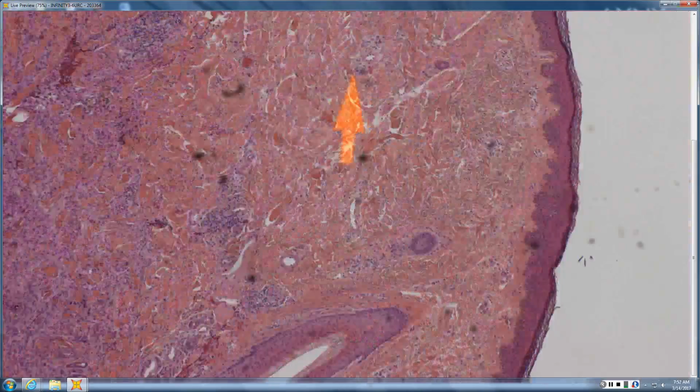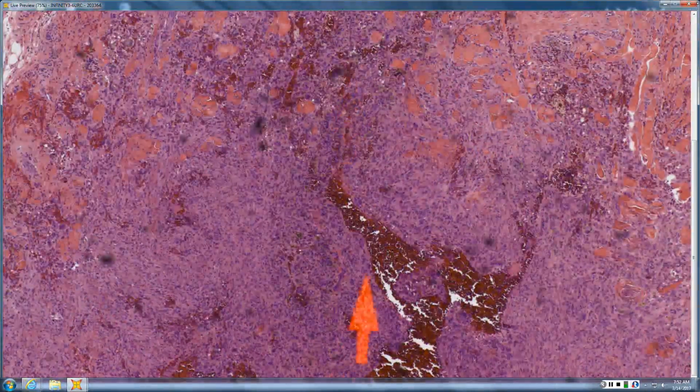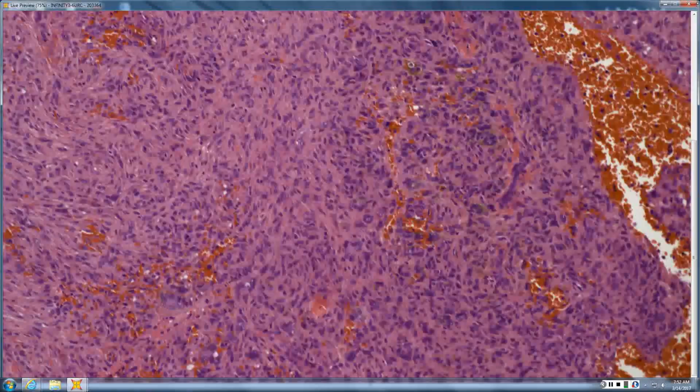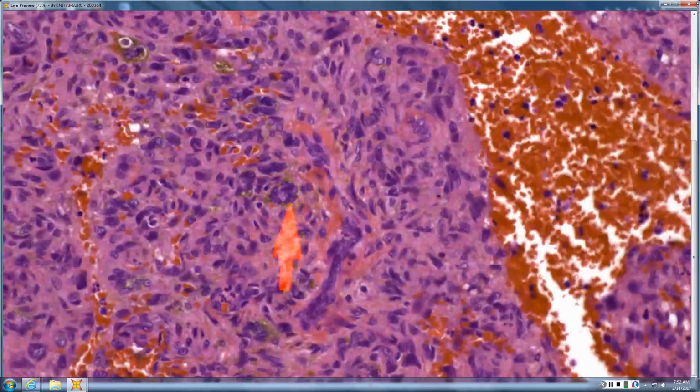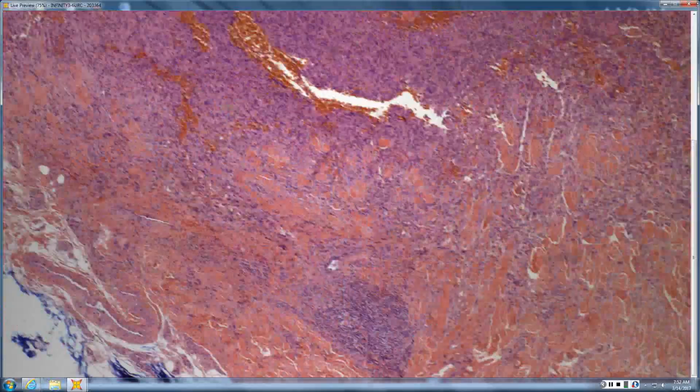This has the overall architecture of a DF, probably the aneurysmal DF. It has big aneurysmal vessels, big-time collagen trapping with collagen balls, and then you would expect to see ringed siderophages if this is an aneurysmal DF. So you look for areas of brown to see, do you have wreaths of nuclei with the brown around them? If you have ringed siderophages, then that probably is just a variant of a dermatofibroma. DFs come in endless variation.